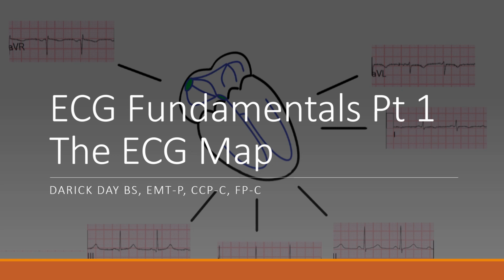And I think a lot of traditional ECG teachings kind of don't focus on this, and I get a lot of people asking where I learned my methodology, and this is it. I took the time and I applied a conceptual understanding of where each of these leads look and what that means. And when I'm interpreting an EKG, it's painting me a picture, and I can apply that to the clinical presentation of the patient to improve my diagnosis.